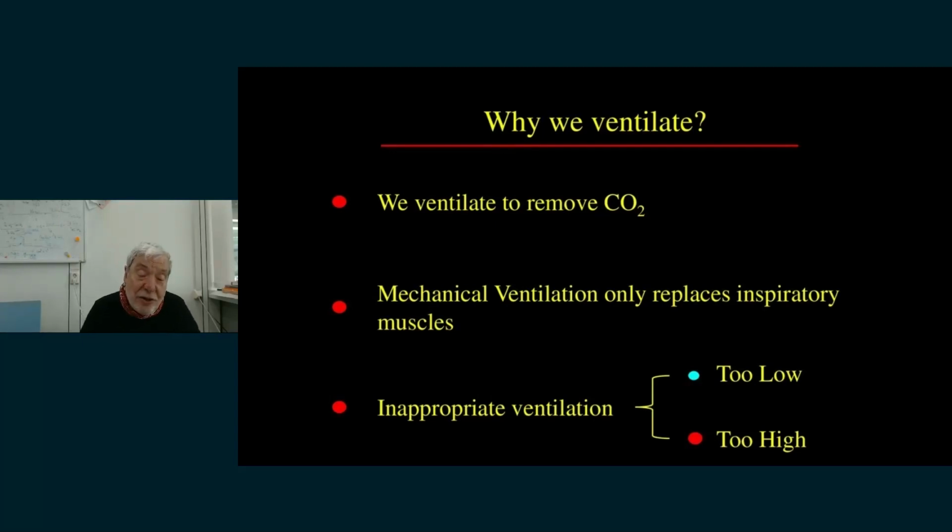And with mechanical ventilation, we do not replace the alveolar endothelial function, the capillary alveolar function. We replace just the respiratory muscles. We provide energy sufficient to move the system. This energy may be too low or may be too high. And we concentrate overall on the too high ventilation, the inappropriate ventilation, which may be equally, if not more, dangerous than the lower ventilation.